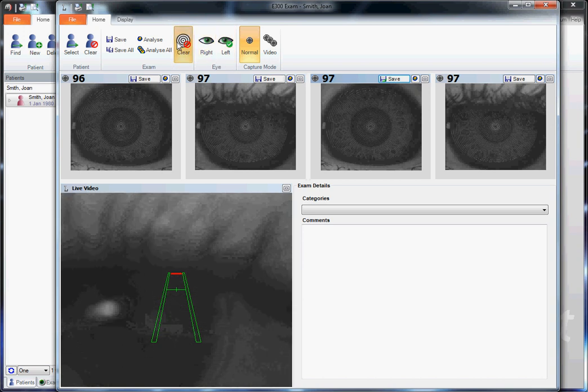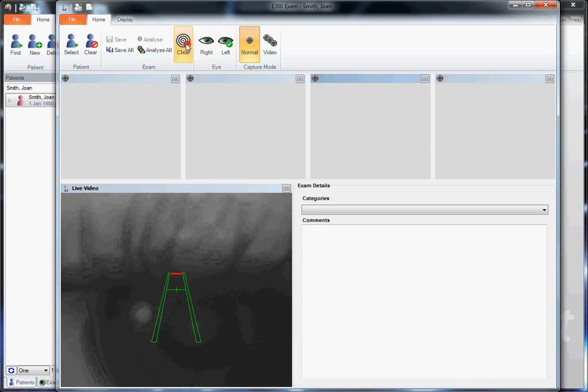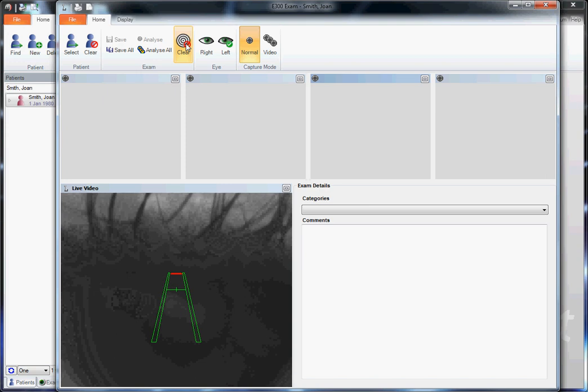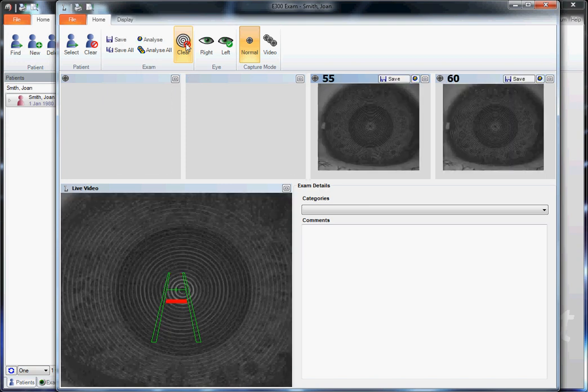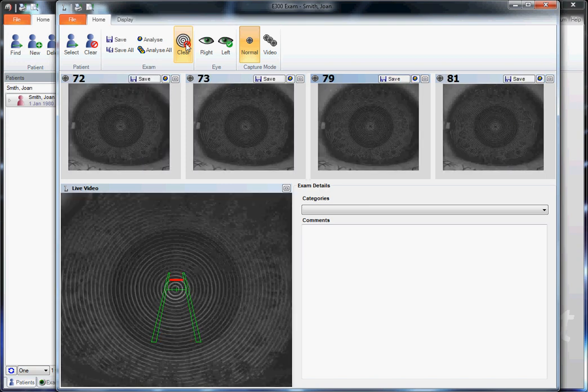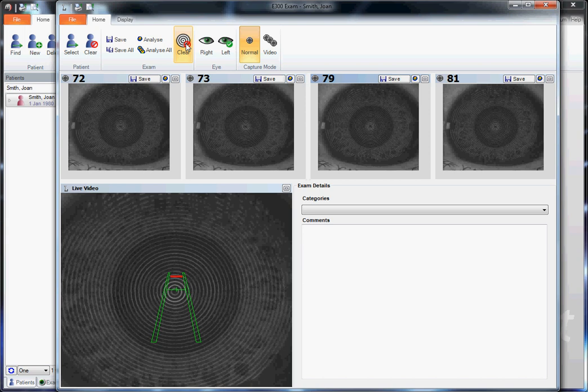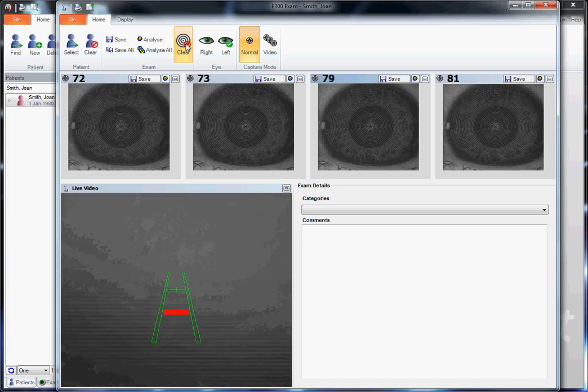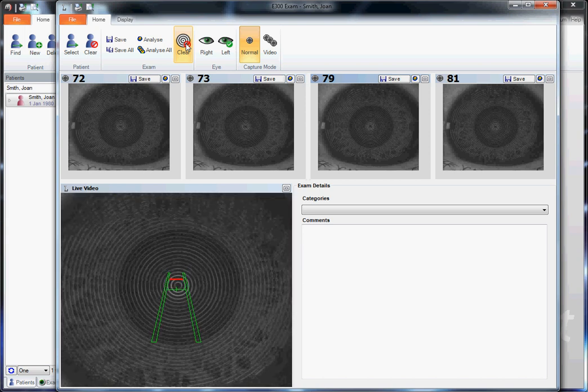Why don't we clear images, and this time we'll ask our patient to reach around the chin rest and gently pull down on their cheek so we can open up the fissure a little bit more. Again, we'll ask our patient to blink just prior to centering the unit.